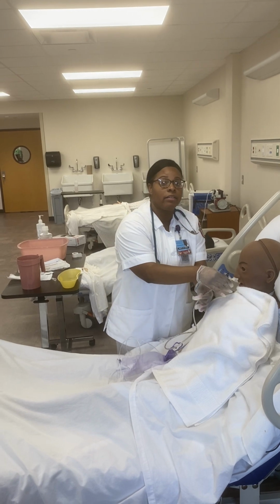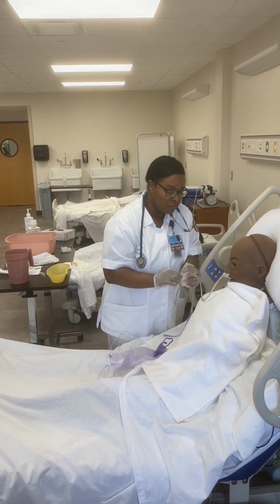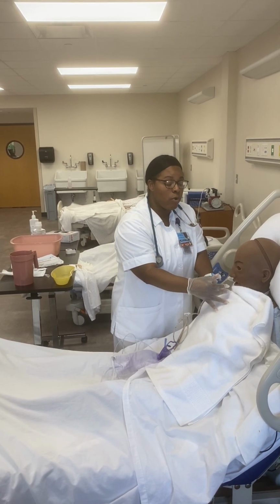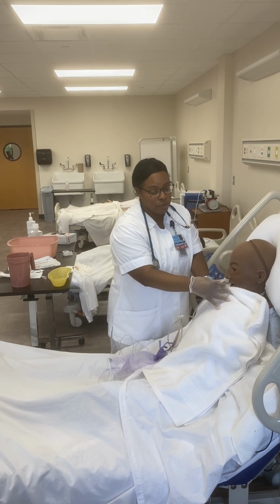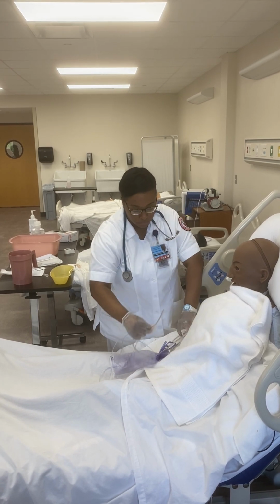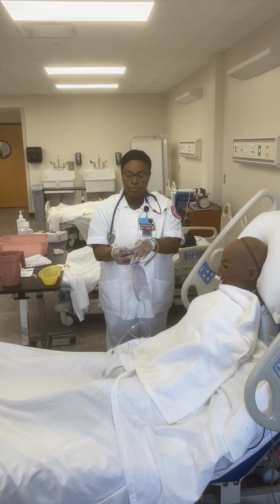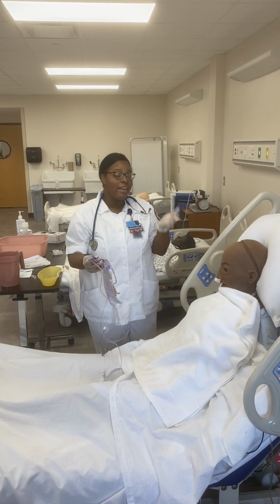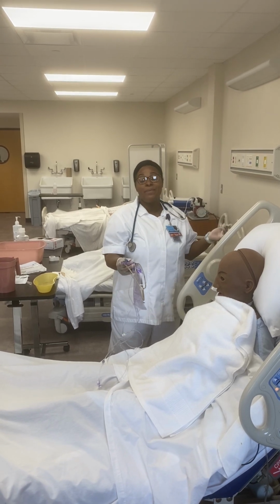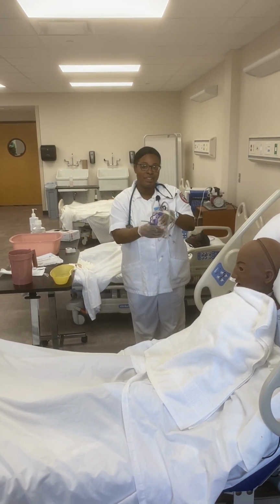All right, while asking my client to hold their breath, I'm going to slowly remove the tube. I'm going to discard this into the proper container. But of course, before I removed this tube, I would definitely turn off the feeding or discontinue from suction that it was connected to. And then discard this into the proper disposable container.